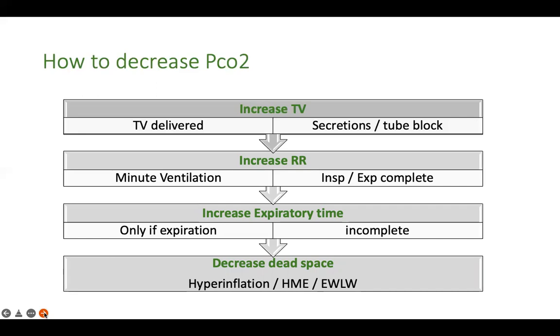And similarly, one more thing. In a ventilated child, these are the 4 things that you really need to remember. In a non-ventilated child, in chronic hypoventilation patients, the PCO2 may go up if you give too much oxygen, because that takes away their drive to breathe. In chronic hypoventilation, it is mainly the hypoxia that drives the breathing. The CO2 does not drive the breathing there. So there you have to always target a saturation around 95, but that is not regarding ventilated patients, because in ventilated patients you are controlling the drive. So in ventilated patients, these 4 things need to be always kept in mind.